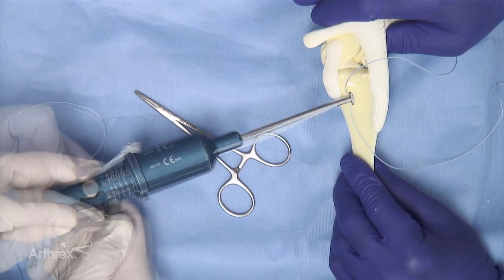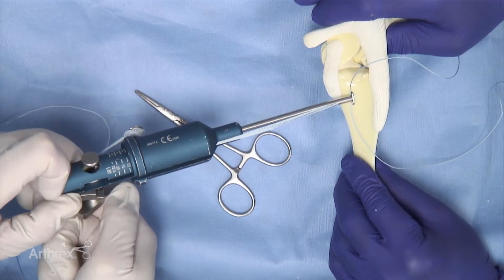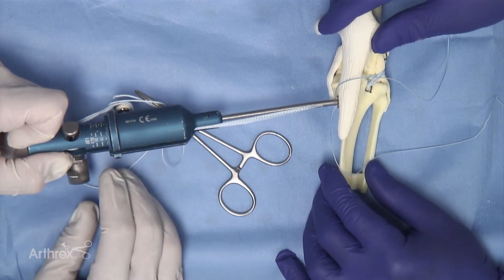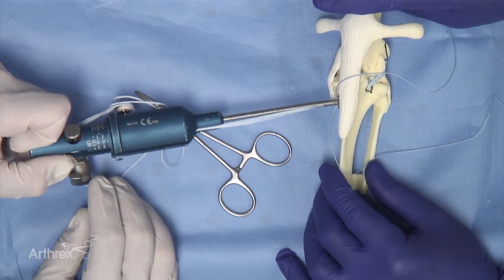In medium to large dogs we use ten pounds of force, which can be read on the sliding scale. Once the tensometer reaches that ten pound level it can be maintained. The implant can be inspected, and if satisfied, one can in the clinical case move the limb through a range of motion to decrease the amount of creep or loosening in the implant prior to tying.